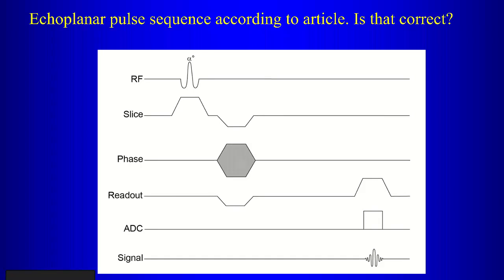Yeah, so this is a gradient echo sequence. The alpha angle there is less than 90 degrees. But notice, what's the other clue that this is not a spin echo? There's no 180-degree pulse, right? So how do they focus the signal to get a signal at this particular point in time, at this TE? How did they do that? There's no spin echo, so how do you get a signal here? What focused the signal here?